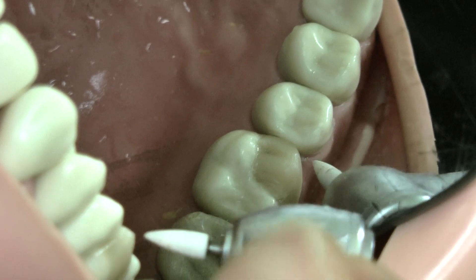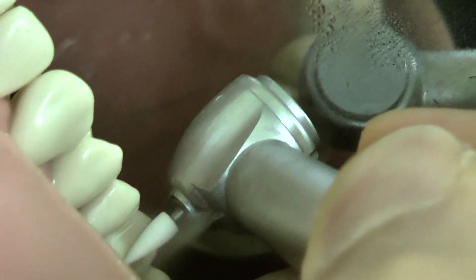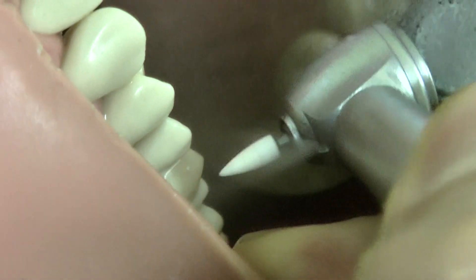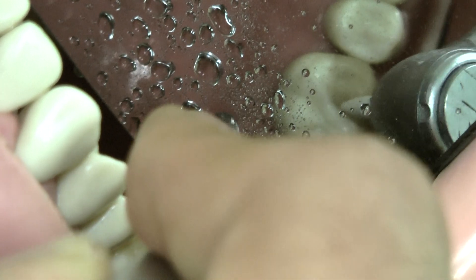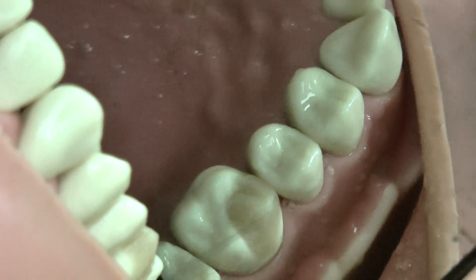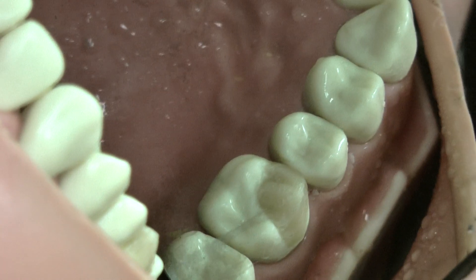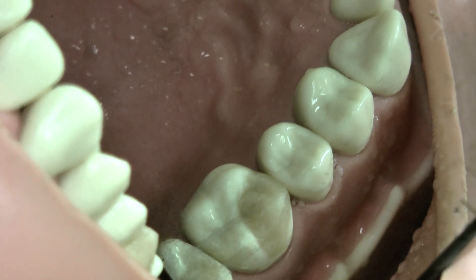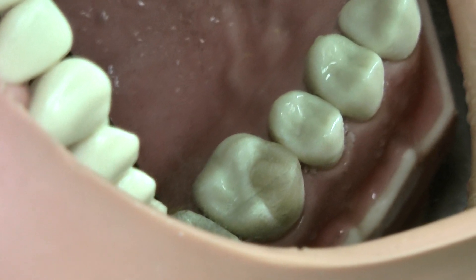For polishing we can use a white stone as well as a Sof-Lex disc. I prefer white stone — be careful because white stone can easily damage the adjacencies. Now the work is done: cusp buildup is complete, we have the marginal ridge, the cusp is rounded and not square at the corners, and we have a nice tight contact. You'll need to check your contact with floss. That's the end of the demonstration — I hope this can help.